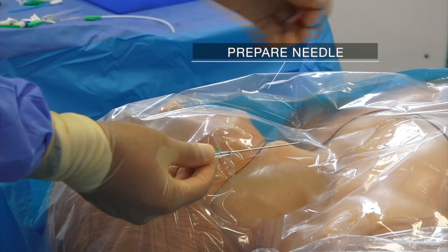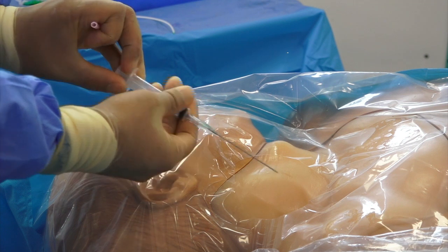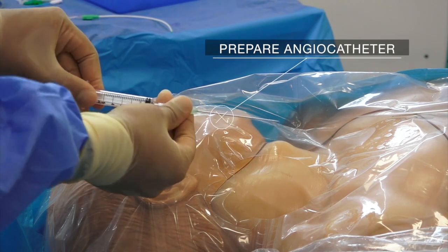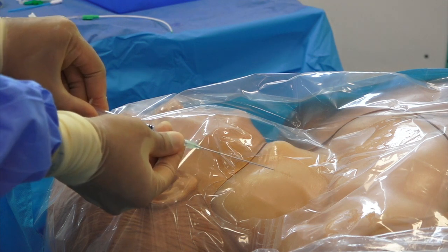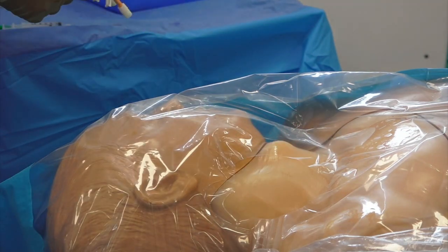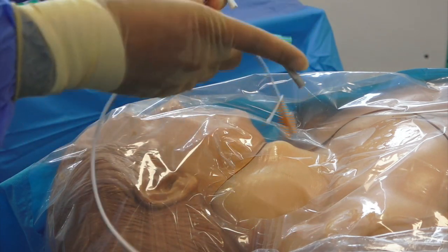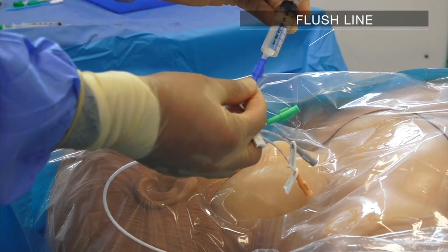Attach the needle supplied in the central venous cannulation kit to a syringe. Alternatively, if using an angiocatheter technique, attach the angiocatheter to a syringe and ensure the angiocatheter easily slides. Prepare the central venous catheter by flushing all ports with sterile normal saline and locking all ports except the distal port.